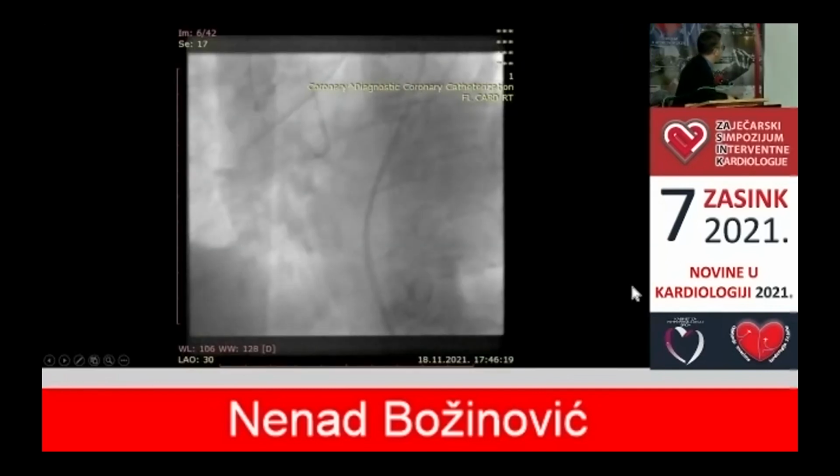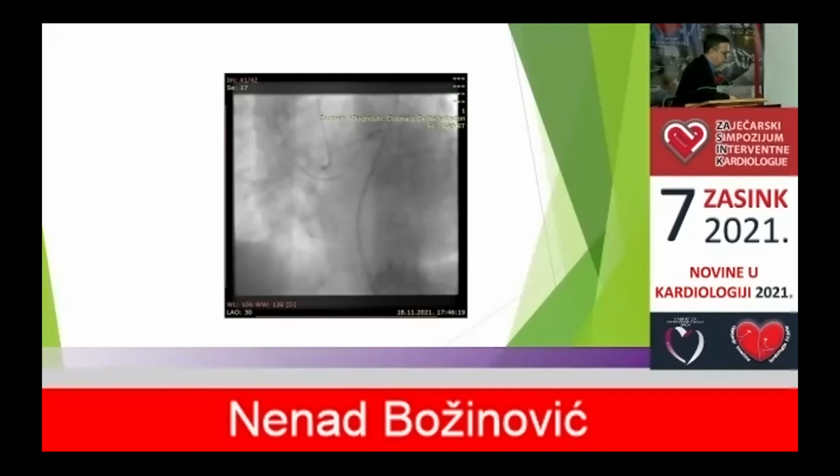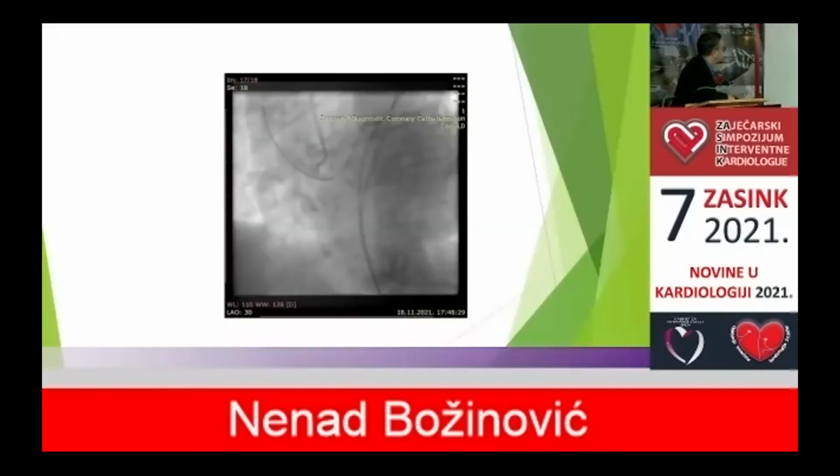And now for the support, this is a retrograde balloon. No, this is next. This is a retrograde trapping balloon. So I have the antegrade wire in the retrograde micro, and then trap both of them, the retrograde micro and the tip of the antegrade wire, in the retrograde system with a standard classic trapping balloon. This is 6 French, this is 2.0 at 14 atmospheres, trapping all that antegrade system now in the retrograde guide. And no extra money, 200 euros for RG3, and this is very safe, I think.